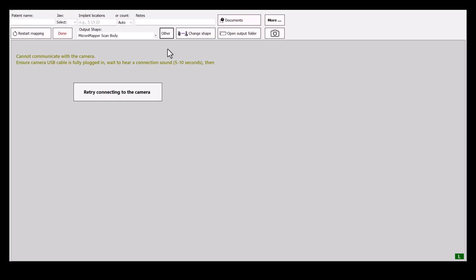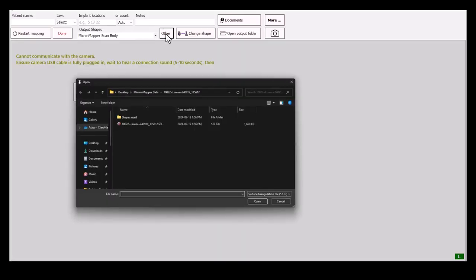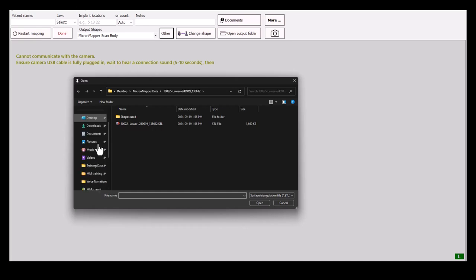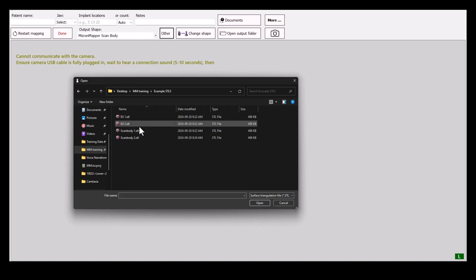To do so, click on Others. Then, navigate to the folder that contains the STLs you wish to import. Once located, select one and finish importing by clicking Open.